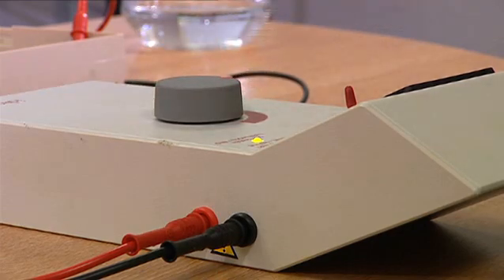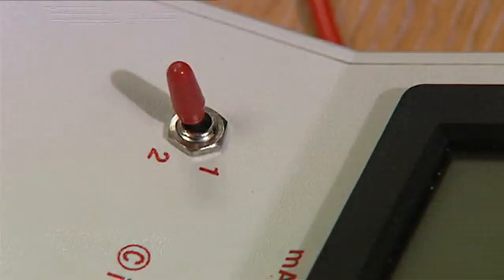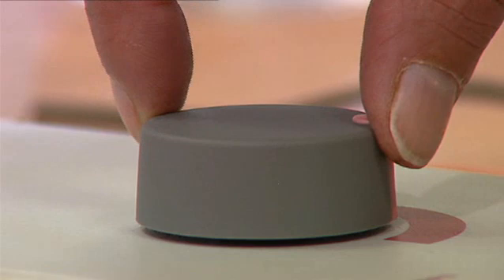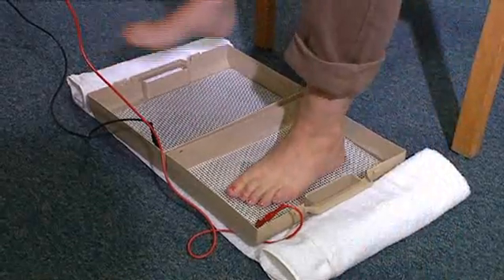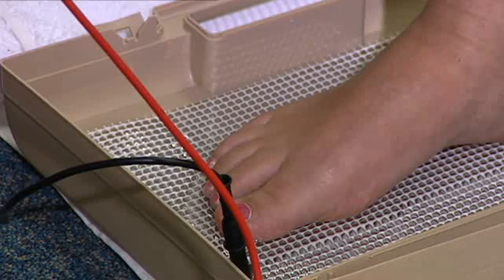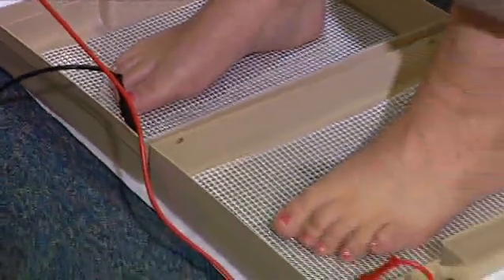Switch the polarity switch from 1 to 2 and ask your operator to then slowly increase the power again to a comfortable level for a further 10 minutes before bringing the power down again. The procedure is the same for treatment of the feet with the treatment bars placed on the floor. However, if you are treating the feet, the treatment is for 15 minutes on each polarity.